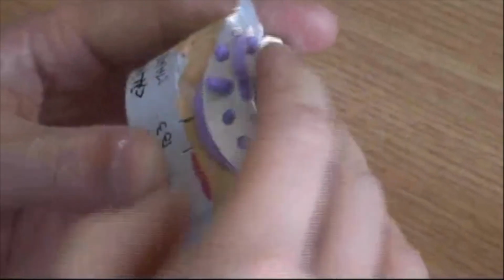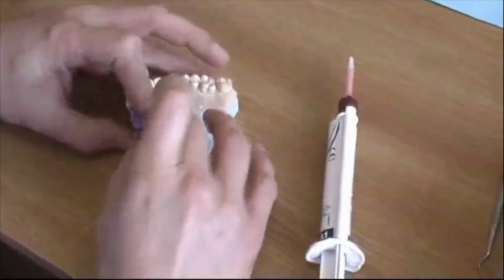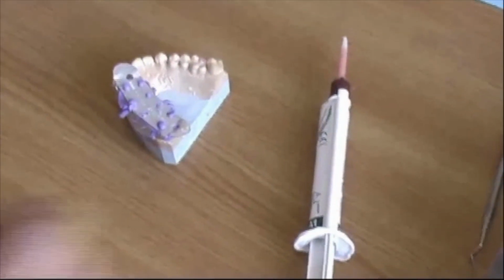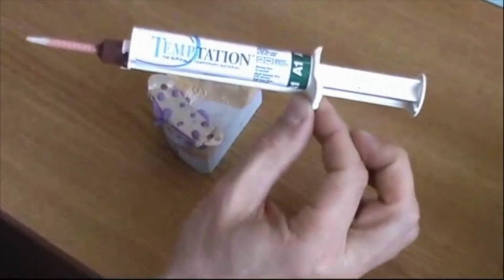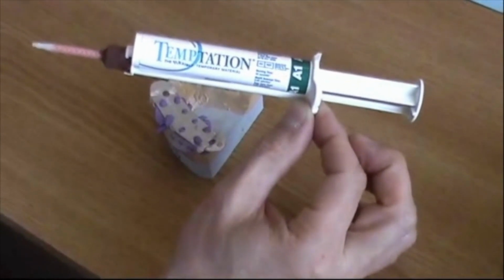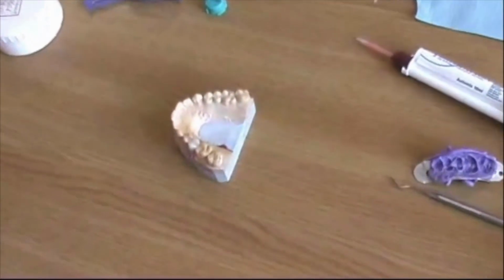Around 2 minutes setting time, it depends, and you press it. Of course not on the tooth, because you trimmed the tooth. You cleansed everything from the tooth. The cavities are not there anymore. You want to make a temporary crown on the tooth that you have prepared, right? And this is one of the resins that can be used. It's a very good one from Clinician's Choice.